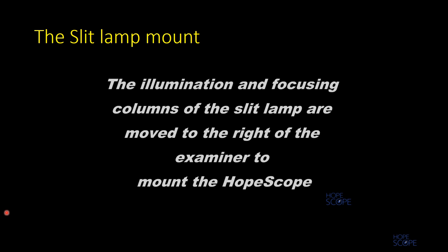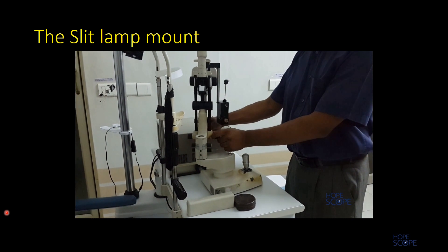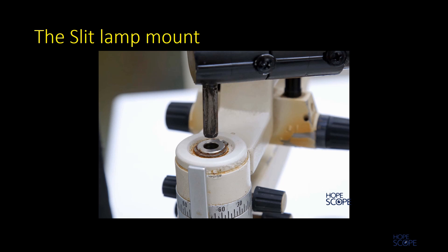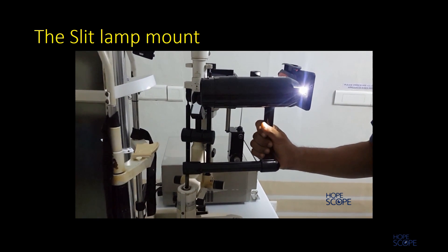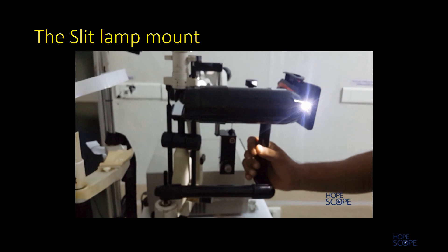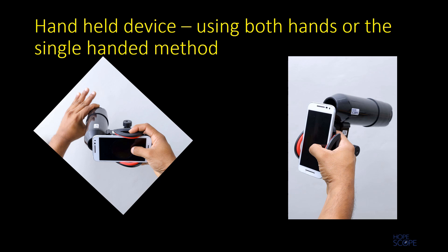After moving the illumination and focusing columns of the slit lamp, the correct base pin is placed in the slot, as seen in this video.